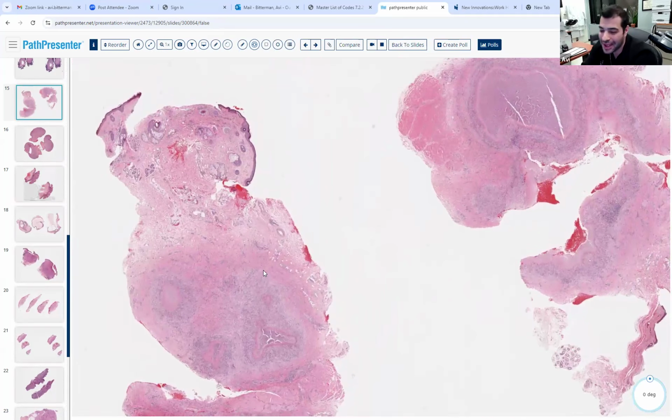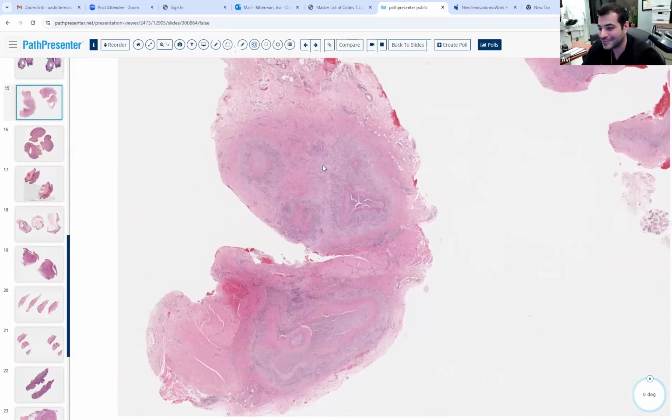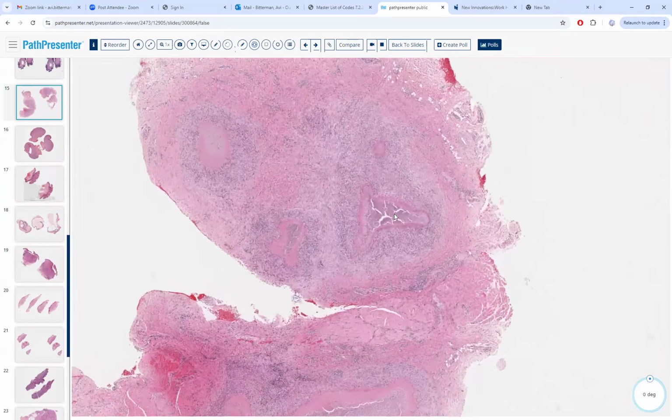Okay, fine. If you're a lumper or a splitter, I'm going to ask you three things. If you're a splitter and you believe granulomatous rosacea is a separate entity from lupus miliaris disseminatus faciei, which not everyone does, fine, we'll give you two. But then what else is on your differential? Tuberculosis.